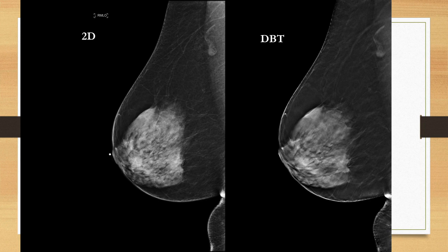Here is a cut from a 3D image. And you can see right here, this is a mass. It's irregular. We're looking at the shape. You see all these lines coming out from it? We call it spiculated. So it's a spiculated mass right there. In retrospect, you're like, oh, it is a little dense there. But it was also a little dense here, and here. You wouldn't have called it and you wouldn't have seen these spiculations without the 3D. So that's a cancer that you would not have picked up.